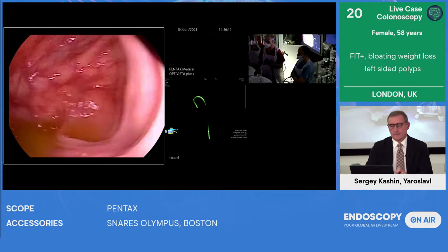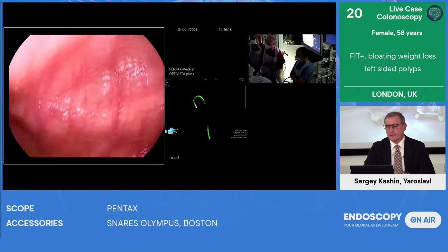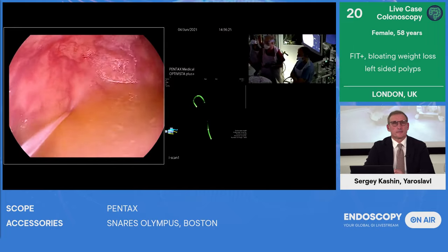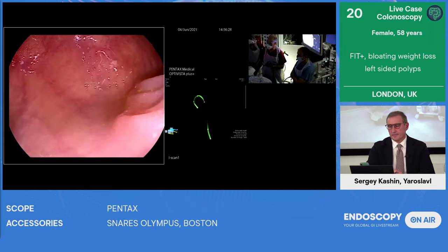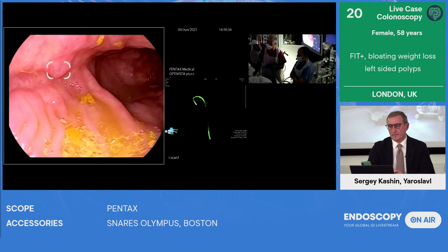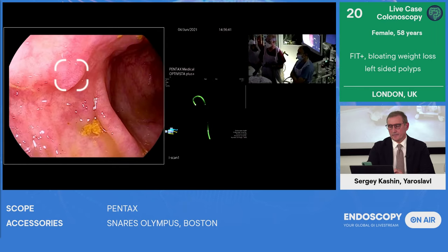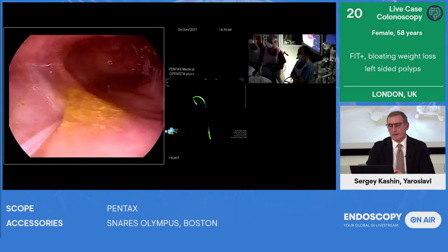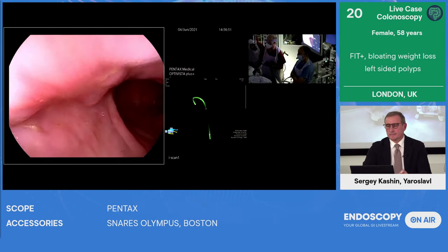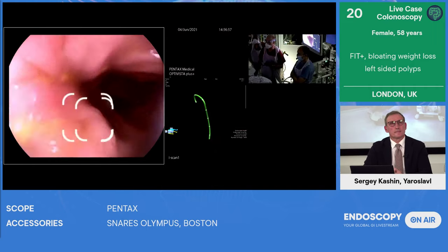Of course, when you're an experienced colonoscopist, you hope that you'd be able to pick most of them up without the need for artificial intelligence. But I think for the less experienced, it may well be useful. And the preliminary data does seem to show an advantage. But I think it's the beginning of the journey, and I'm sure the systems will get progressively more accurate. And when they include characterization, that's just a vein underneath the mucosal surface that it's picking up, that's not a polyp. When it gets more accurate and combines characterization, I think it'll be very compelling at that point. So I think we're at the beginning of that journey, and there will be significant improvements just around the corner that'll make it very useful.